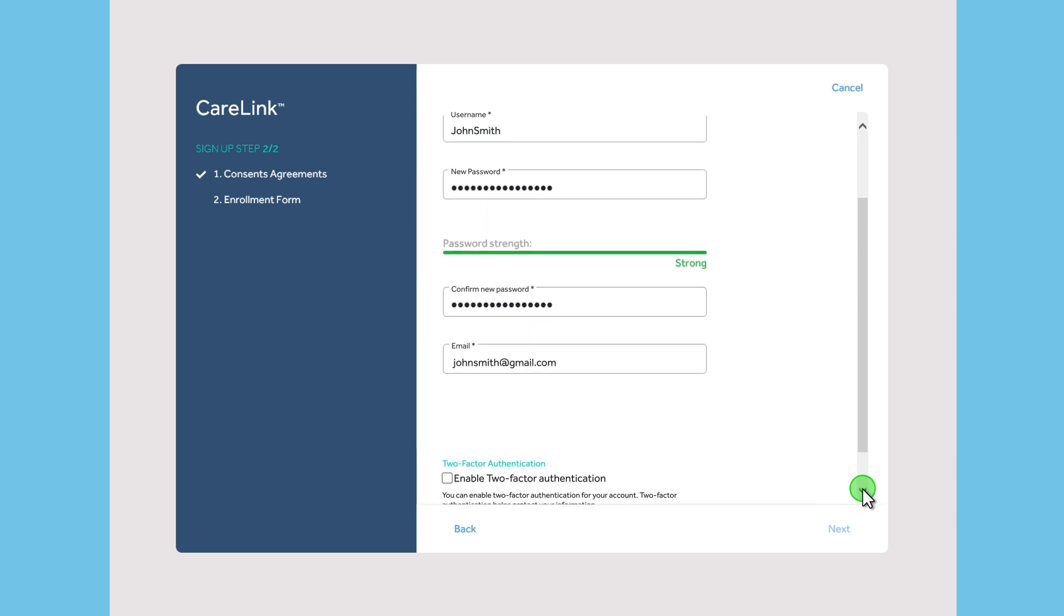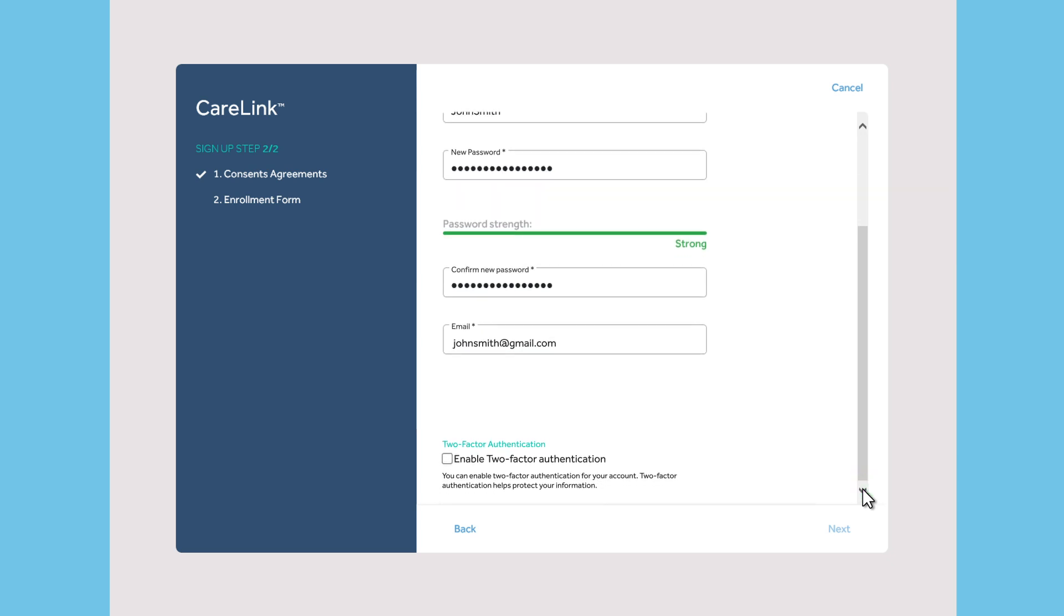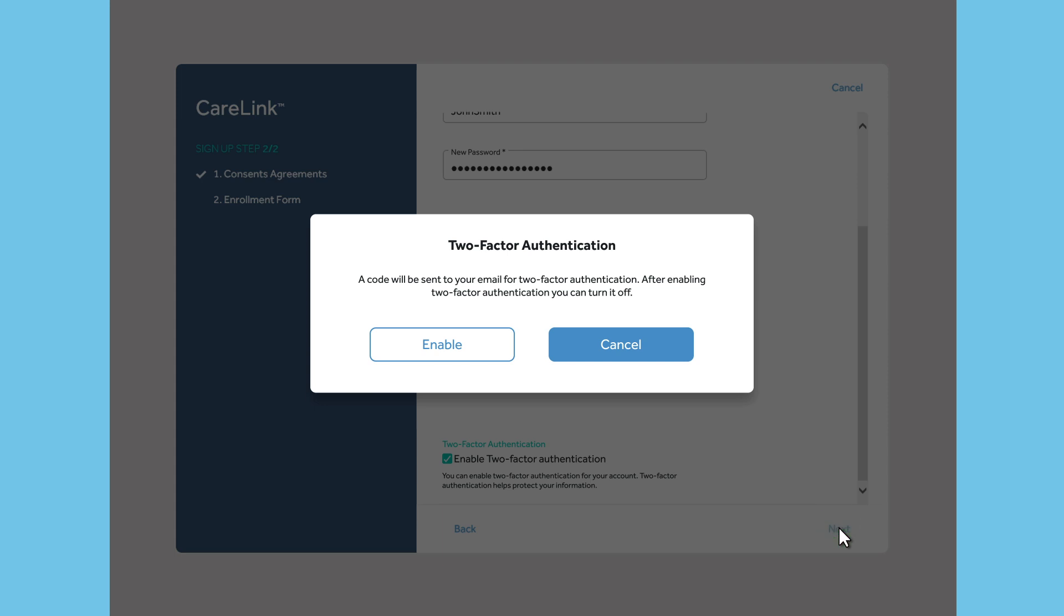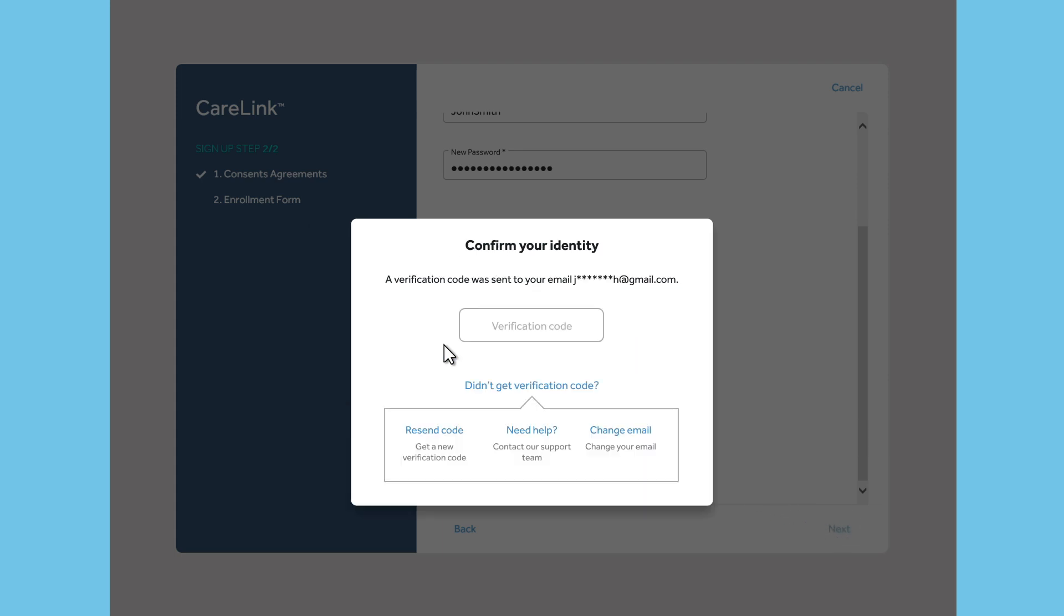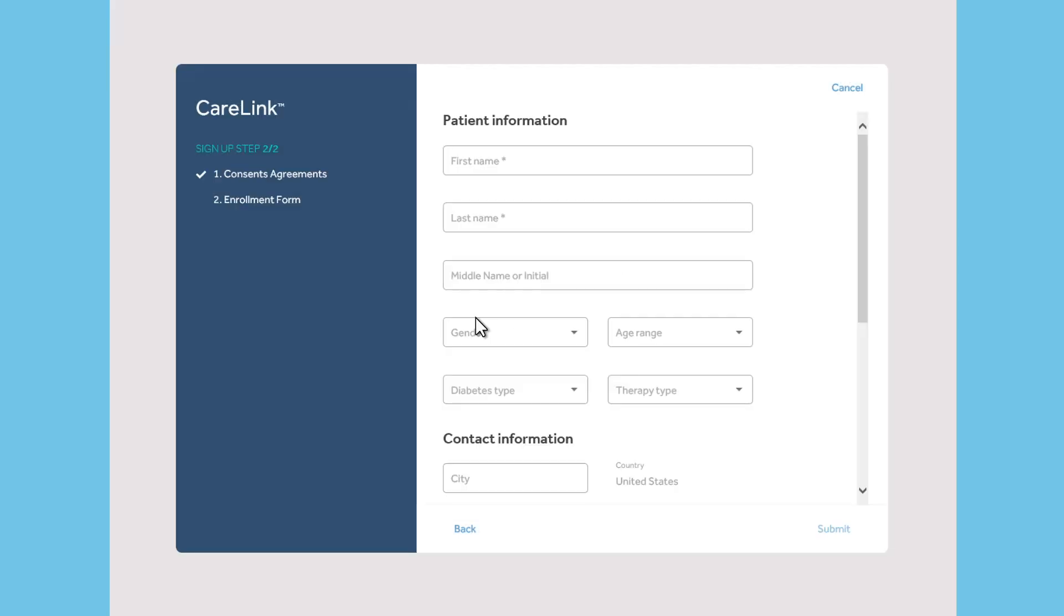Some countries allow two-factor authentication. If you check the box to enable two-factor authentication, a confirmation code will be sent to the email you provided. You will be asked to enter that code before you complete the registration process.